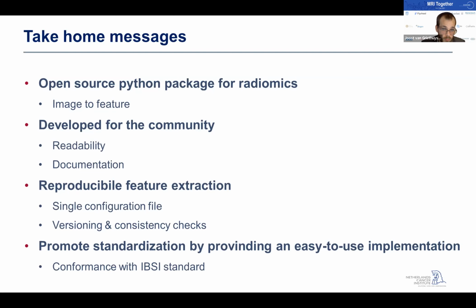takes you from image to feature, and then hopefully helps you to develop a very predictive model later on. It was developed with the specific aim of generating a research community, with special care for readability of the code and also extensive documentation, helping in reproducible feature extraction through a single configuration file, but also the versioning of the software and the automated consistency checks.